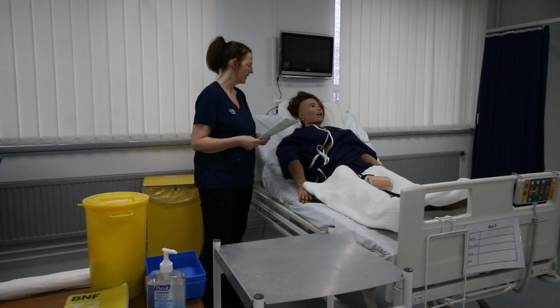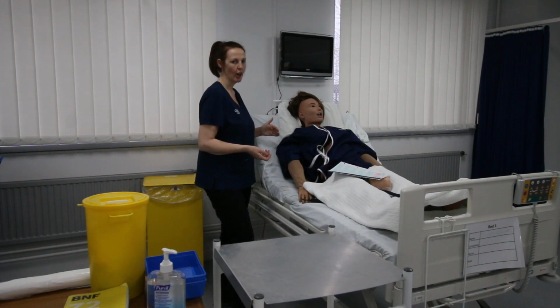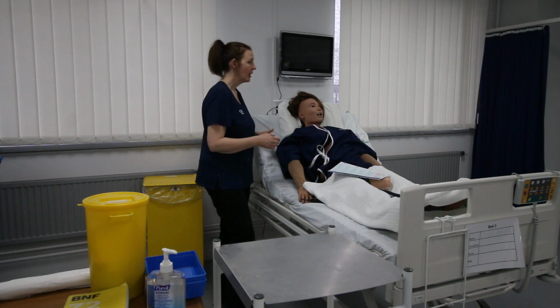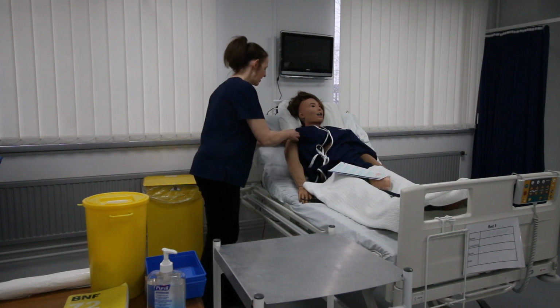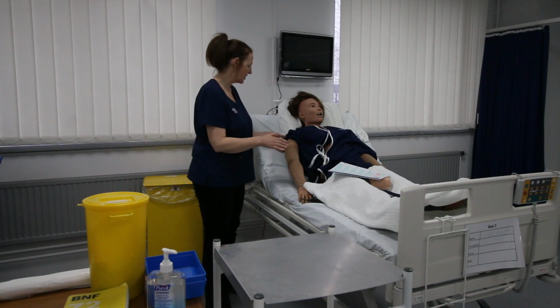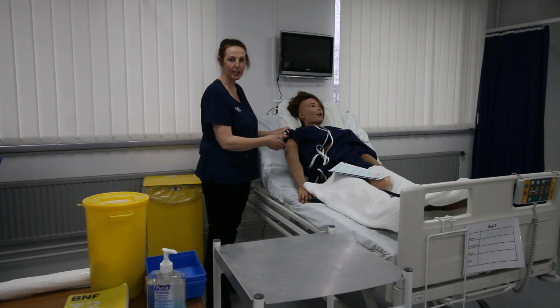Okay. Is it okay if I inject it into your arm? Is that okay? Yes. Is it okay if I inject it on this arm? Yep, that's fine. Okay. I'm just going to lift your top. Is that okay? So I can just look at your arm. Yep. I've checked all the doors and windows are closed and I'm maintaining patient's privacy and dignity. I'm just going to cite my injection site, which is on this arm, and I can see that the deltoid muscle is free of any breaks in the skin, tattoos, anything like that, and this will be a fine site to use, and the patient is happy for me to use it.